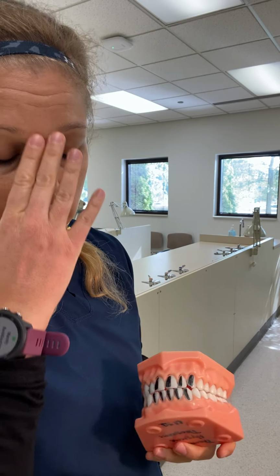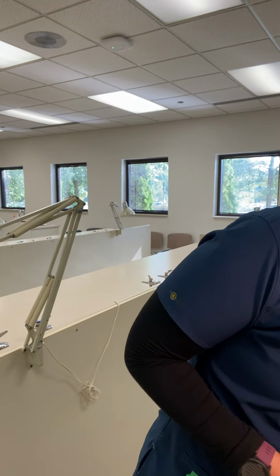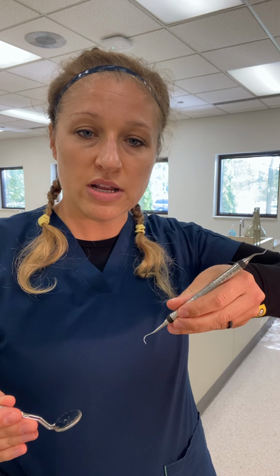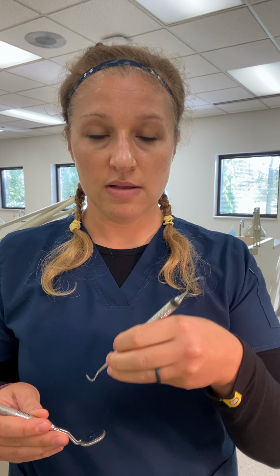And one thing I like to think about whenever I'm treating people or whenever I'm talking to people about surfaces toward and away: you always want to be treating so that your dominant hand is working toward your non-dominant hand, like this direction. You don't want to turn it backwards and go this direction. So can you already see with my posture and my neutral posture and positioning that going this way is a lot more comfortable than turning and going this way? So these chair positions and surfaces toward and away are going to arrange you so that you're working in the right way and you can get the correct angulations. So anterior teeth, you divide in half.